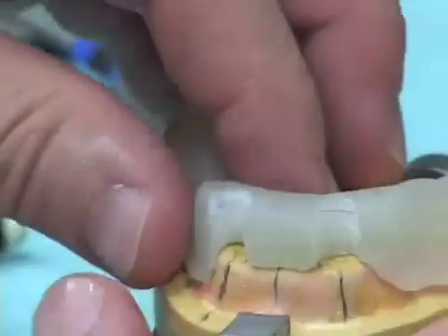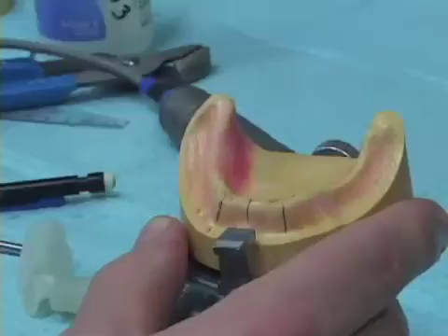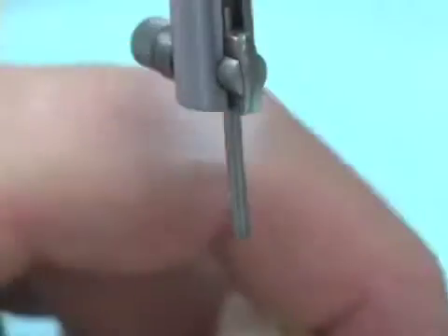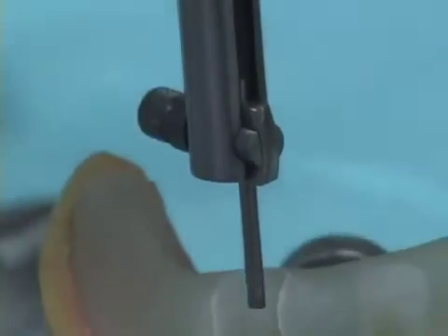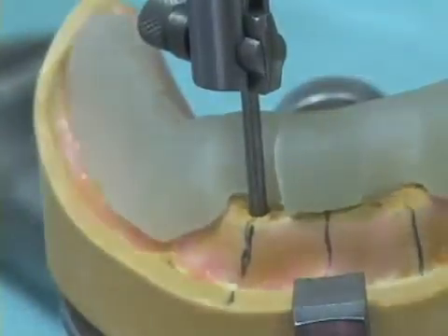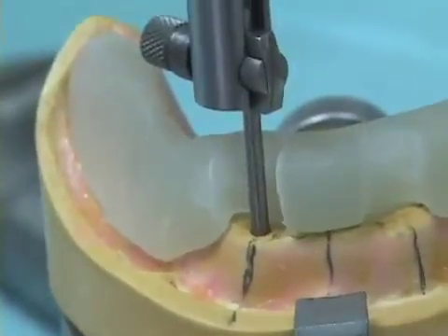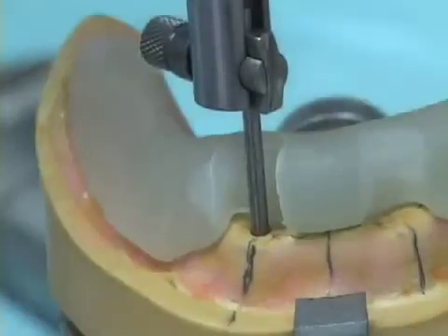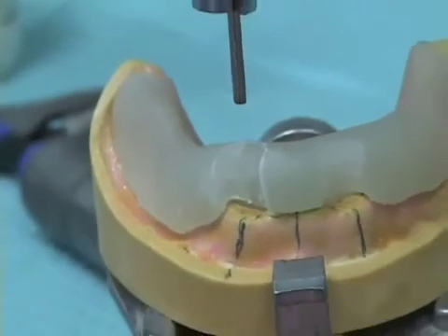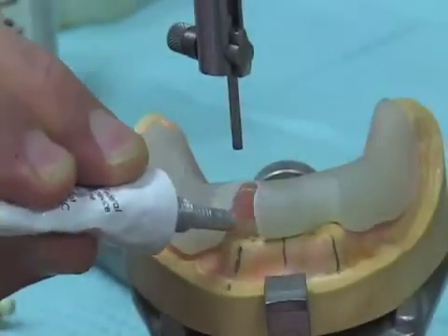Ahead of time, I've made 3 of these: a 2.2 millimeter drill, a 2.8 millimeter drill, and a 3.5 millimeter drill. So this is a 2.2 millimeter drill blank. We do the same thing in terms of orienting it exactly, just perfectly over the place we had selected for our implant location. Remember that we have verified this with a radiograph, so location and angulation are good. Now, lifting straight up in the air without turning at all, we again take triad gel and lower our drill blank right down to our spot on the crest of the ridge.